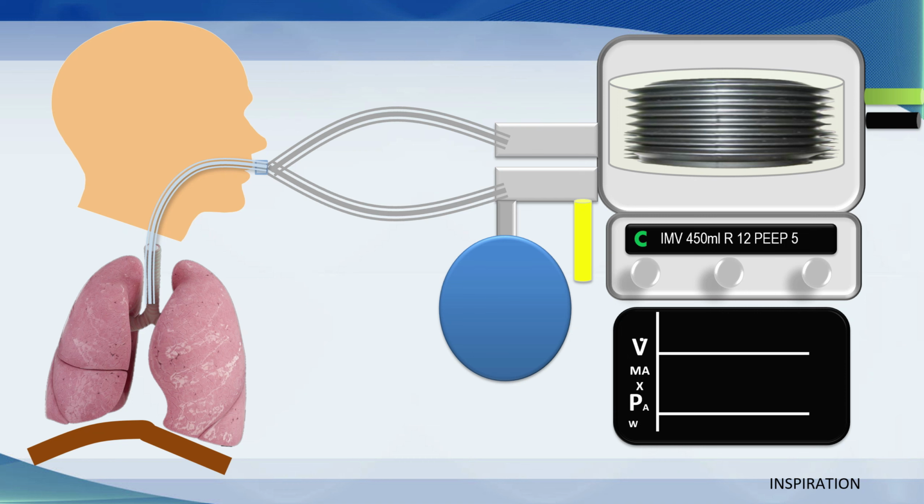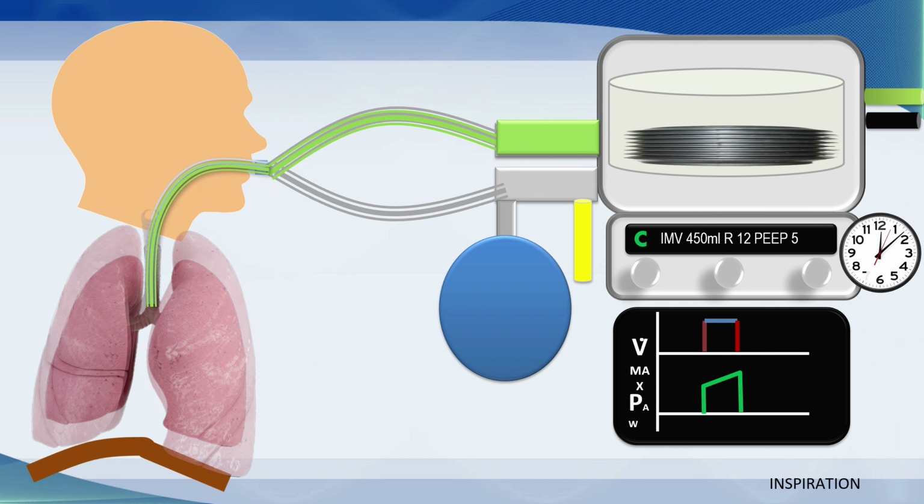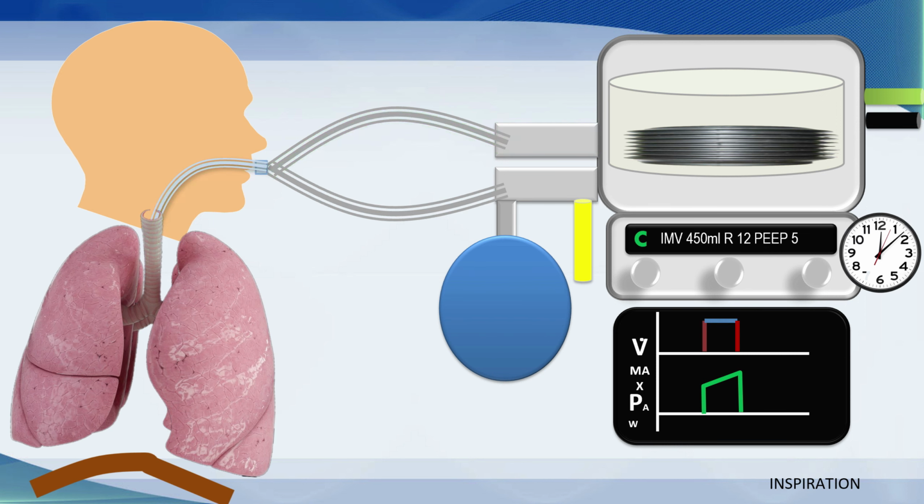You see here that when we actually cycle this ventilator, it's time cycled, the patient gets a breath, and the breath expands the lungs and pushes the diaphragm down. There is essentially no difference between this controlled IMV breath on the ventilator and what we saw with the controlled breath on assist control. The ventilator time triggers and the volume cycles every 5 seconds.